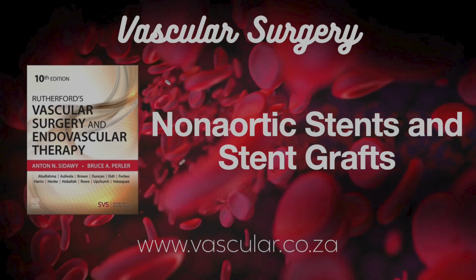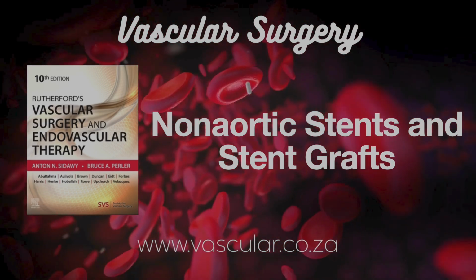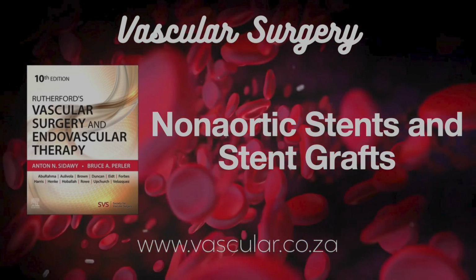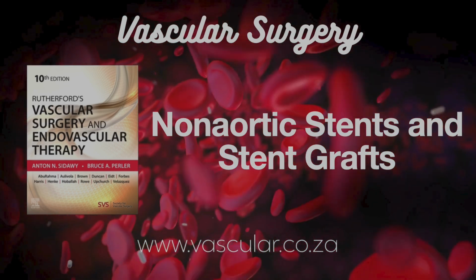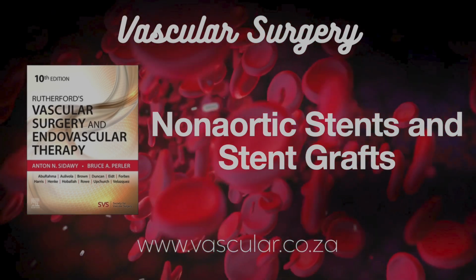The chapter starts with the history, before stents were even really a thing. Angioplasty. Yeah, Dotter and Judkins back in '64, then Grüntzig with the balloons in the '70s. It was revolutionary, just pushing the blockage open. But it wasn't perfect, was it? The chapter highlights some major headaches.